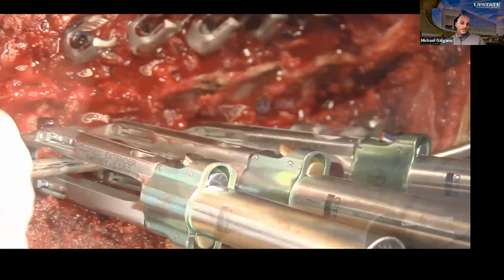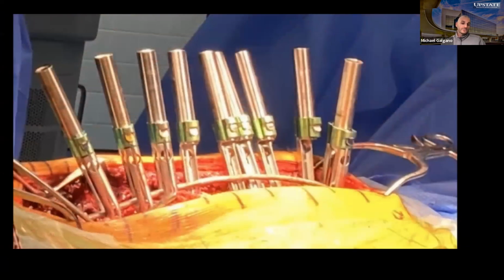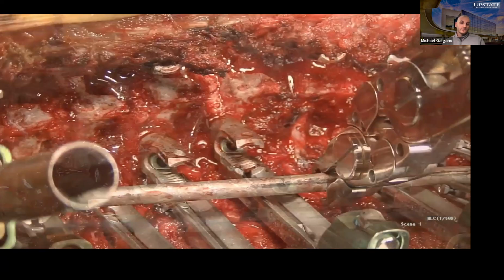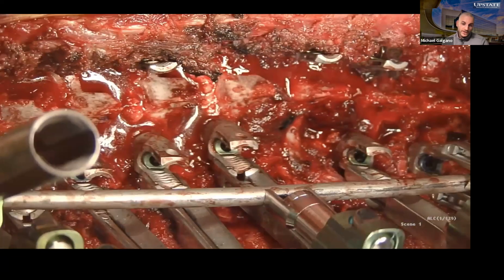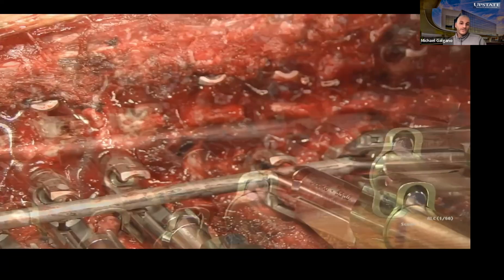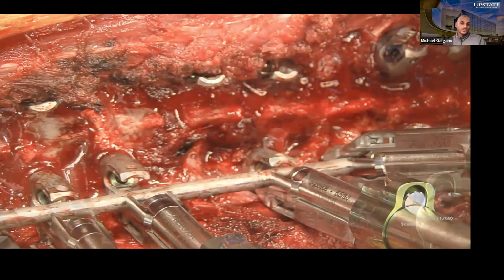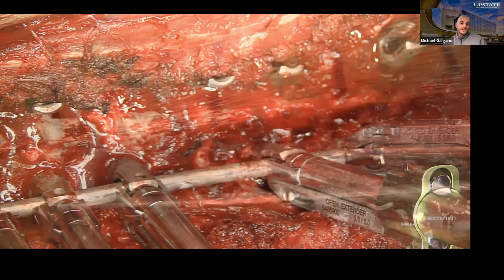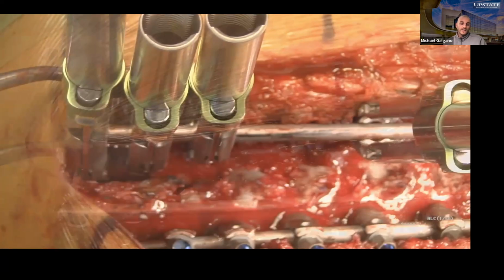And we started off with the concavity of the thoracic spine. And now you can see how far apart the apex of that rod is relative to the spine. And then again, we just do one more final rod rotation maneuver, lock it into place, make sure it's in the proper sagittal alignment. And then we start getting all of our reducers down. And then we bring the spine up to the rod at that point. And then we do the same thing on the contralateral side.